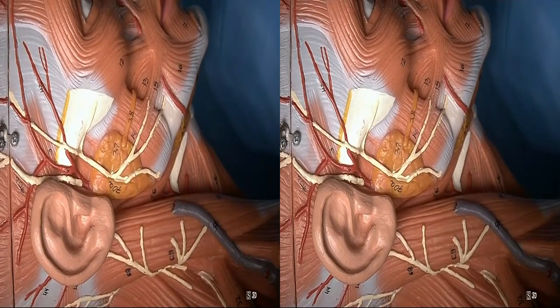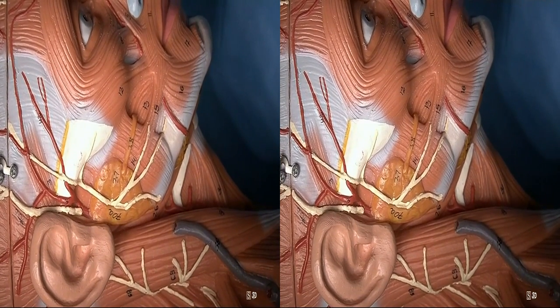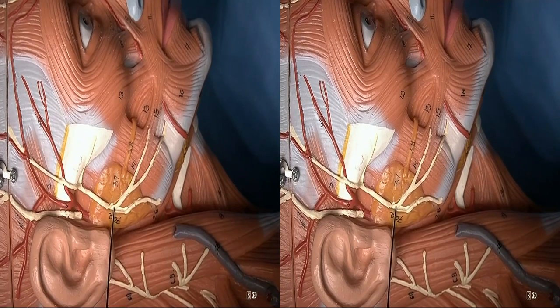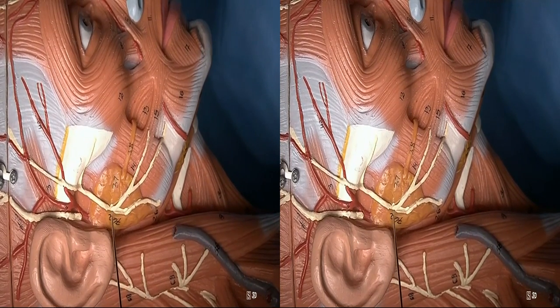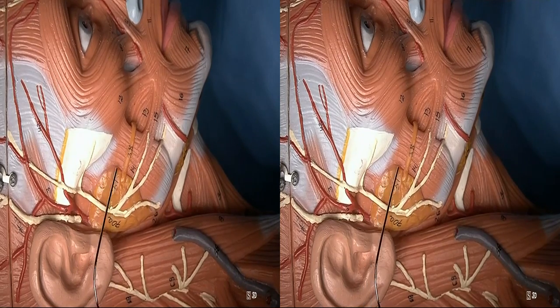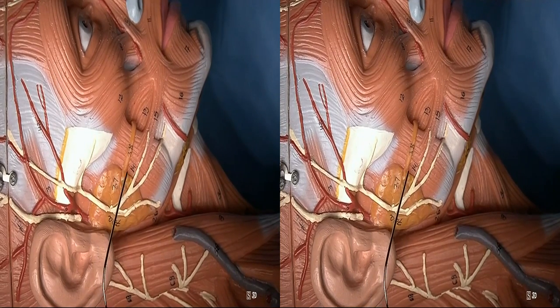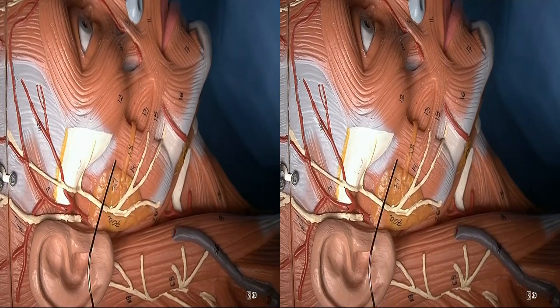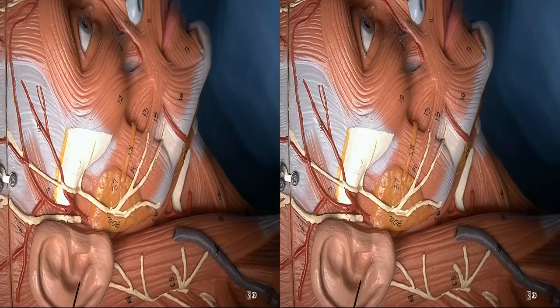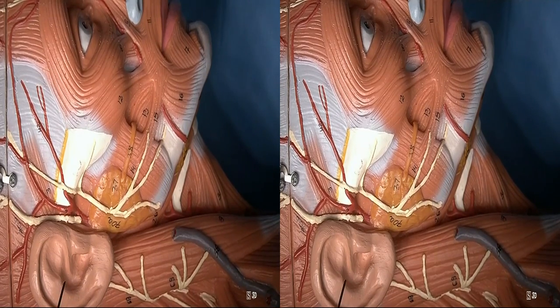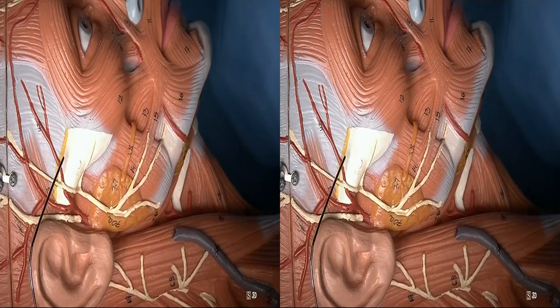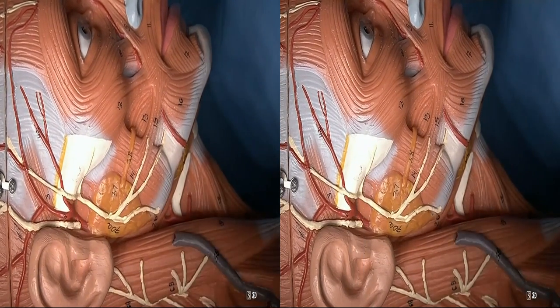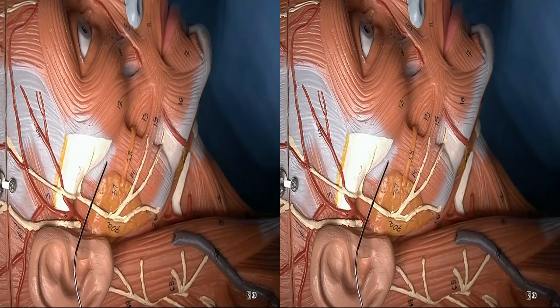On a specimen, on a model, the anatomy depicted of the facial nerve here, within the parotid gland, the main stem would be lower and coming out lateral. We see that just anteriorly to the gland, here in the duct, the masseter muscle is underneath — so it's medial to the gland. And the innervation of the masseter muscle, as we saw before, is coming from the foramen ovale, which will be in the depth, medial to the zygomatic arch here. Here is the zygoma, so coming from the medial side into the muscle.